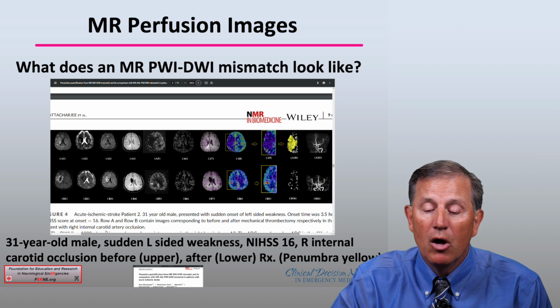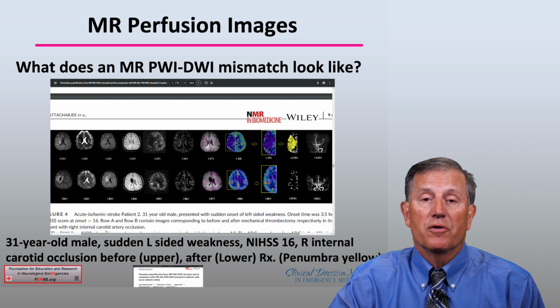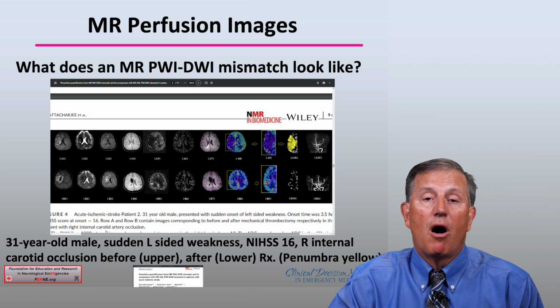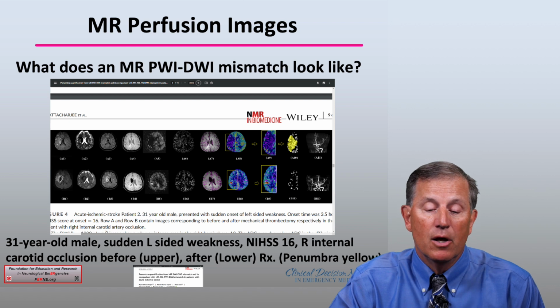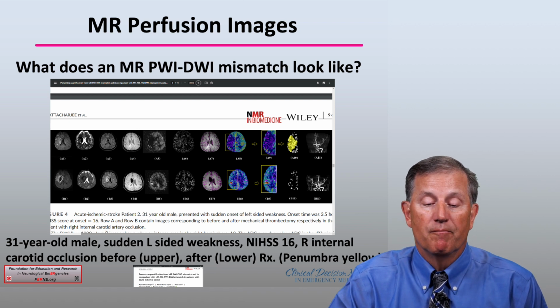And you'd say, well, what was identified at the time that they did a non-contrast CT, a CTA, or CT perfusion? Remember, in patients in whom the likely scenario of a middle cerebral artery being occluded due to some thrombus or embolus, you might use the MR as an alternate therapy or diagnostic for determining the cause of the stroke in patients that are not typical, those who are young, for example, as compared to older patients.